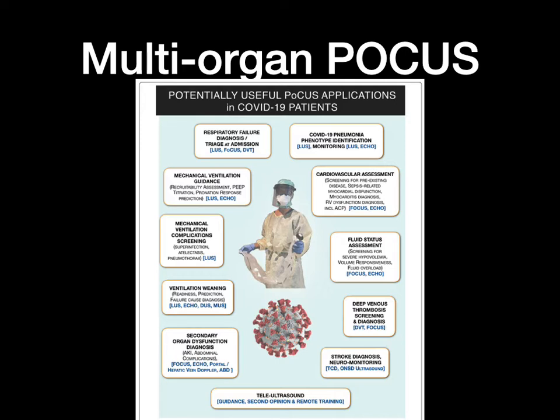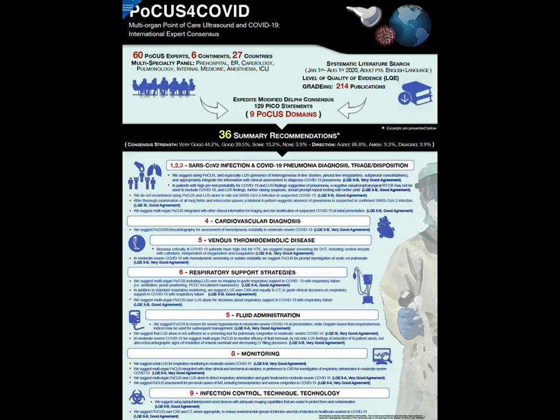And of course, when they are intubated, you can use it to check progress, to check what your intervention did to those patients, like proning, and did it help or not. So lots of uses are recommended for these COVID patients. And then they came up with this nice poster, so you can put it on your ICU wall, and it tells you what to do with these patients, where you can use the ultrasound for these patients.